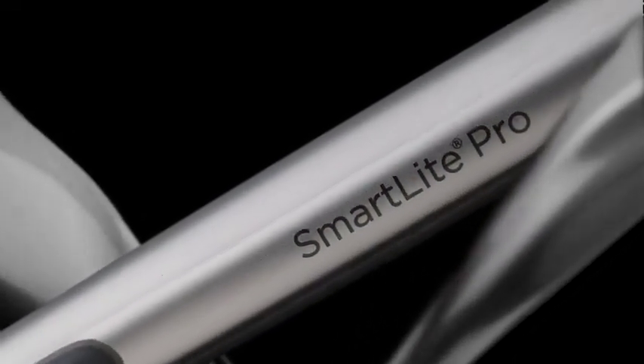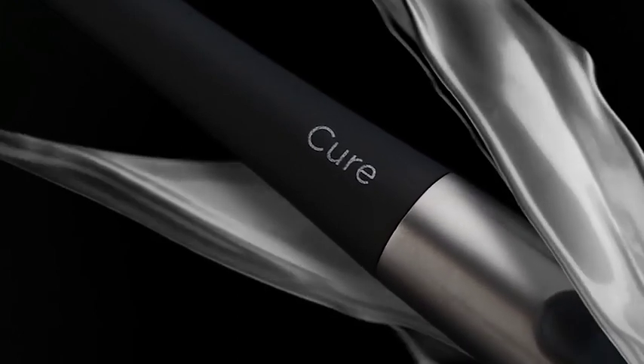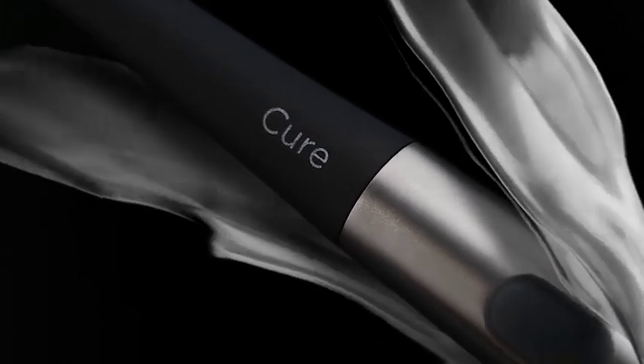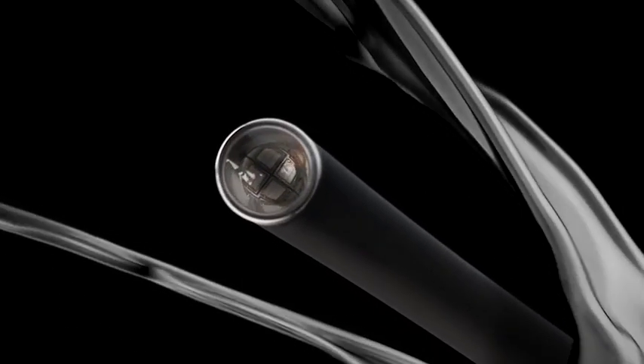Introducing a completely new concept. A remarkable new design that adapts to your needs and delivers performance to help you achieve better and more reliable clinical outcomes. This isn't just another curing light.